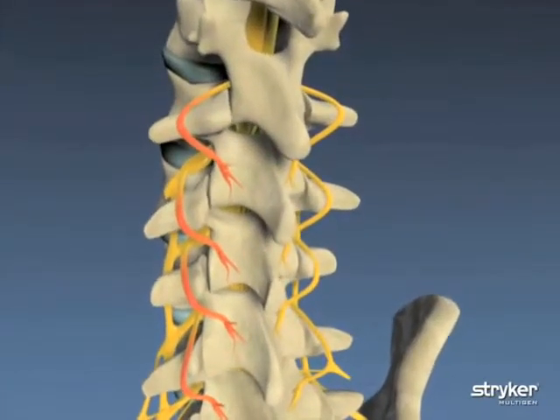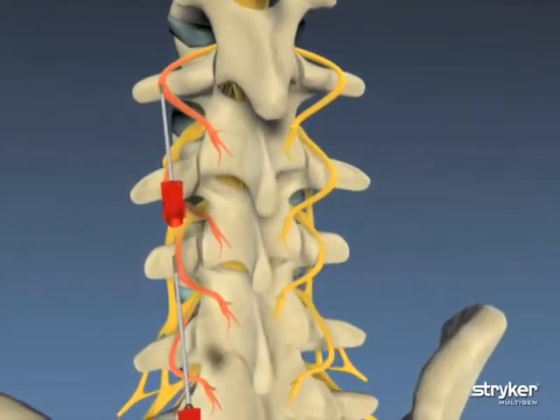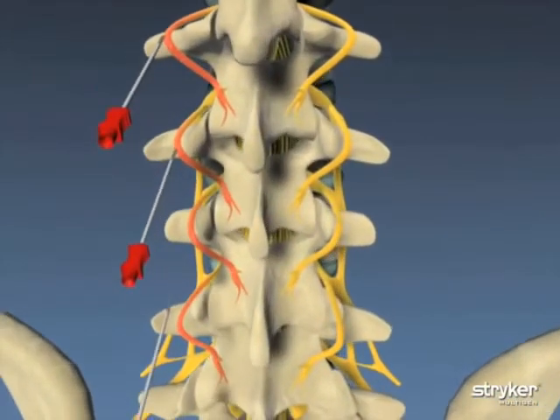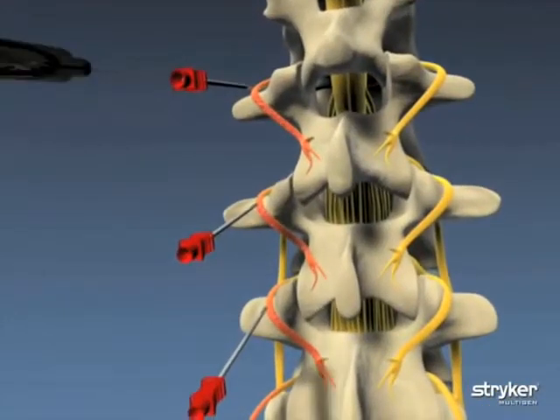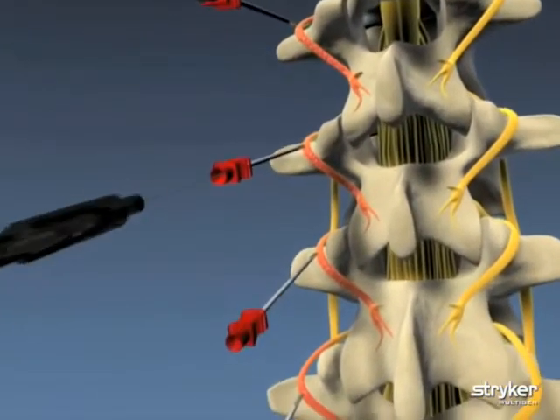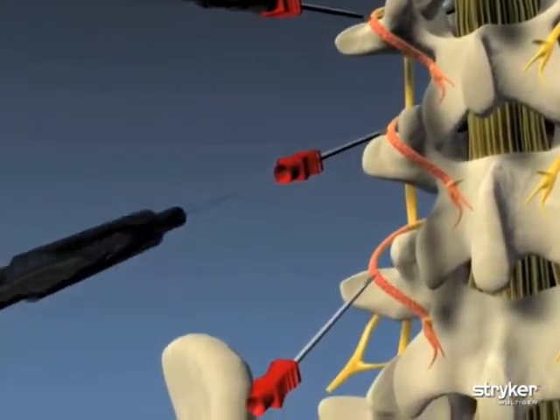To begin, up to four cannulae are carefully introduced in the areas to be treated. Electrodes are then inserted into each cannulae.